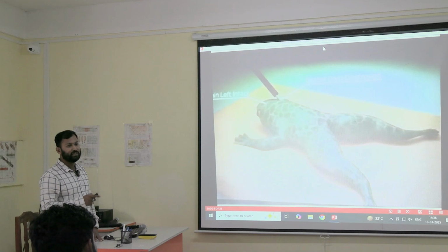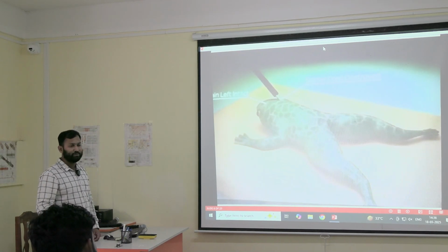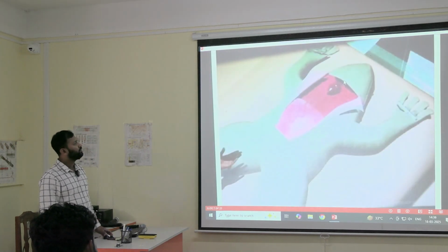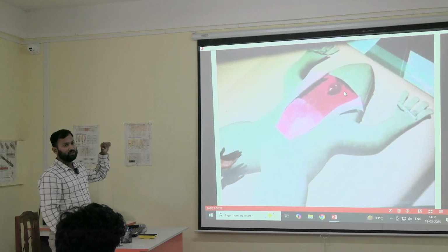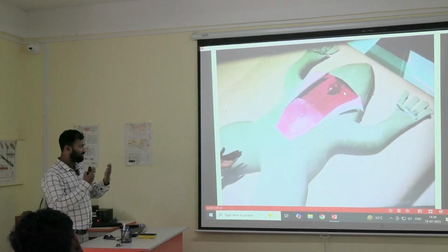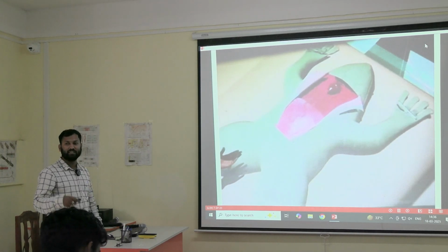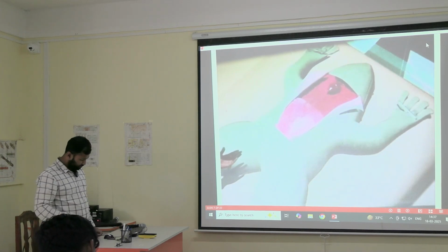So for keeping the function of the vagus nerve intact, because the vagus nerve is coming out from the brain, that's why we are keeping the brain intact, and we are just paralyzing the frog by destroying the spinal cord. So after destroying the spinal cord, we will turn over the frog. We will keep the frog in this position so that the heart faces us. The frog would be lying down and the heart would be facing towards us. So we will first expose the heart. We will cut the different skin layers. We will remove the bones, and then we will expose the heart.